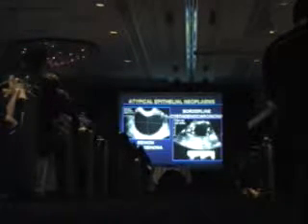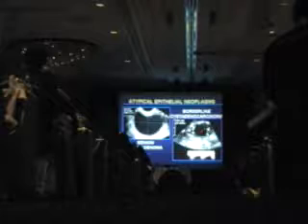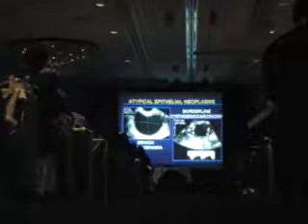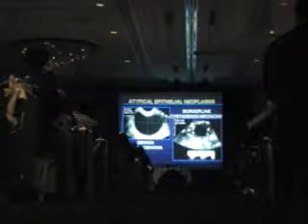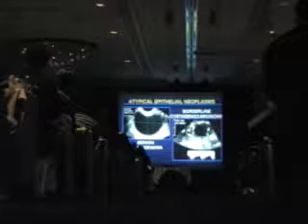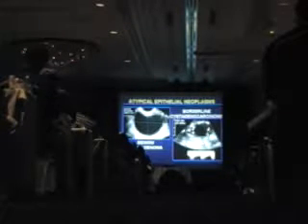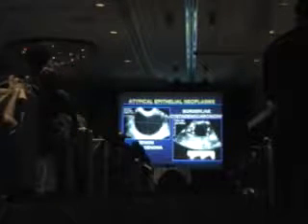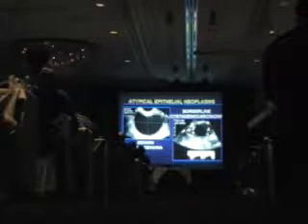Getting back to our postmenopausal woman here, we can see when we put blood flow on this woman, and this is a very important case, because now we see a little bit of blood flow in that postmenopausal patient with a disturbing blood pattern. She's 65 years old. This is not a corpus luteal cyst. This is what we worry about. Yes, we should worry. That's the time you're going to save a life, stage 1 cancer. But if you don't put color on it, look very carefully. We know cancer occurs postmenopausally, so it's important at that point to really use your color and help you.